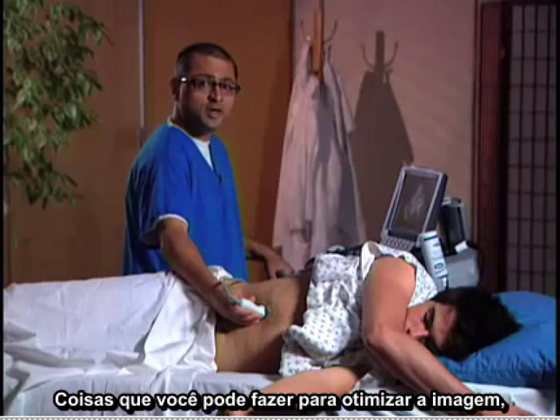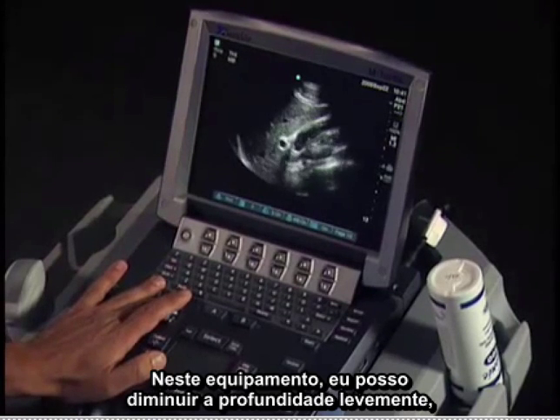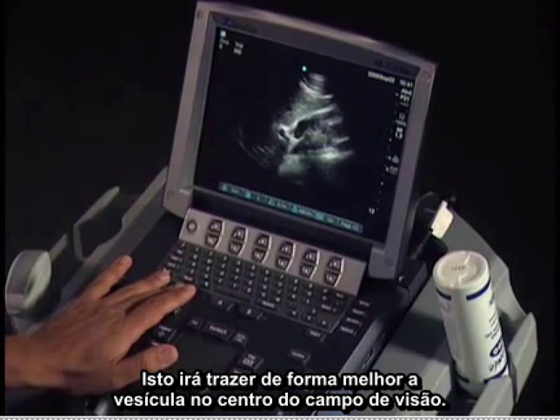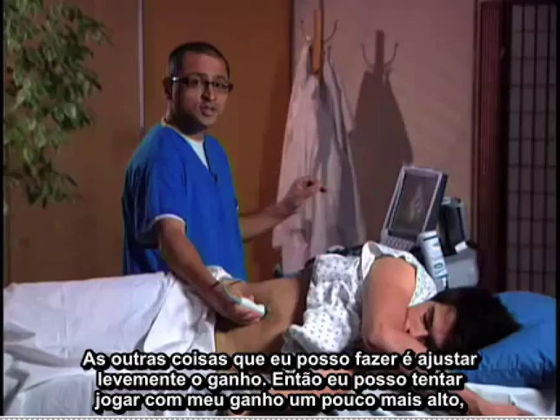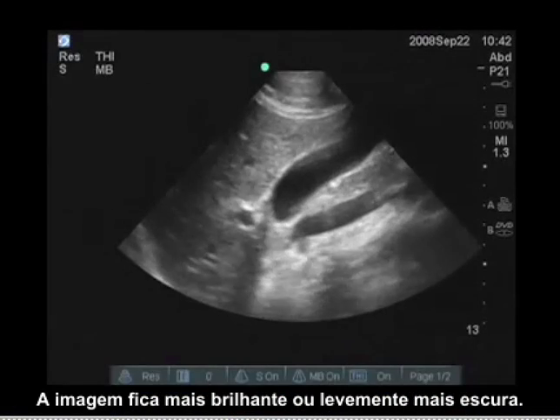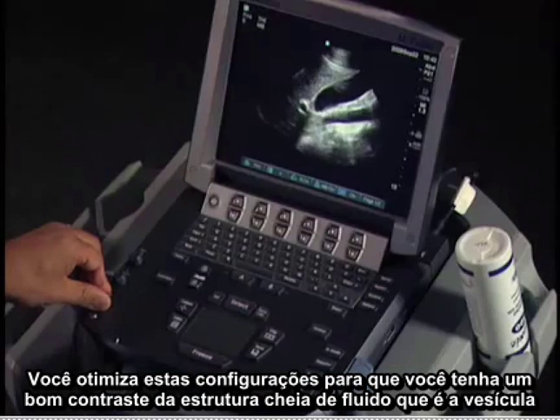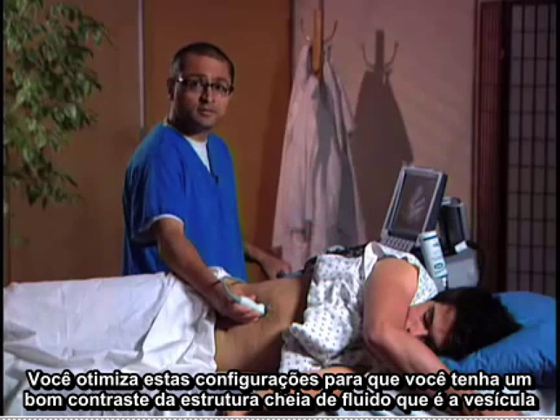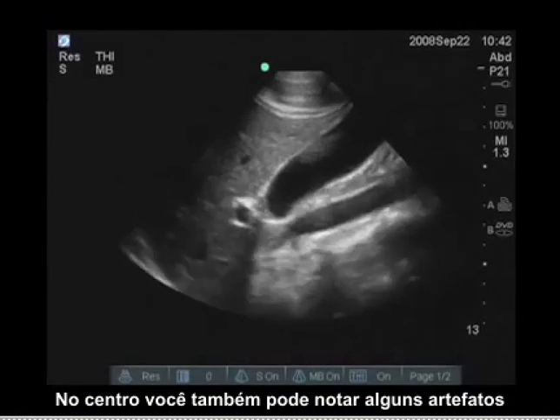Here are things that you can do to optimize that image. First thing you can do is change your depth. In this gentleman, I may decrease the depth just slightly to bring the gallbladder better into mid-center field of view. The other thing I can do is adjust the gain slightly. I can try playing with my gain slightly higher, and you can see the image gets brighter, or slightly lower. You want to optimize these settings so you have good contrast of the fluid-filled structure, which is the gallbladder in the center, and you can also notice any artifacts.